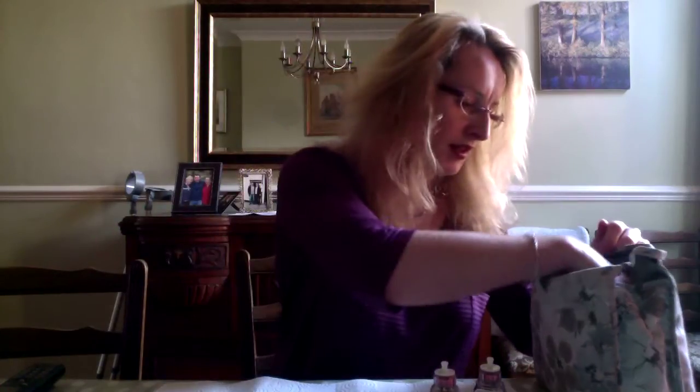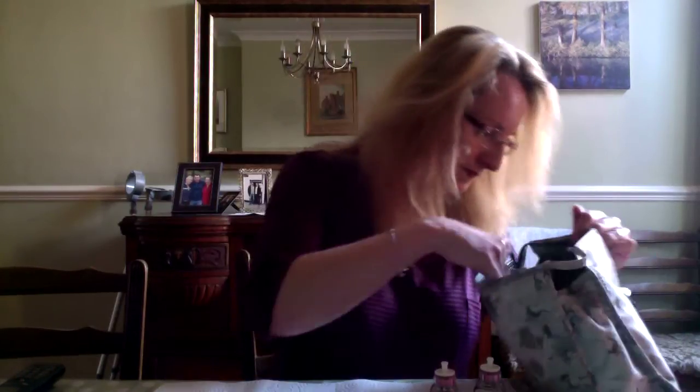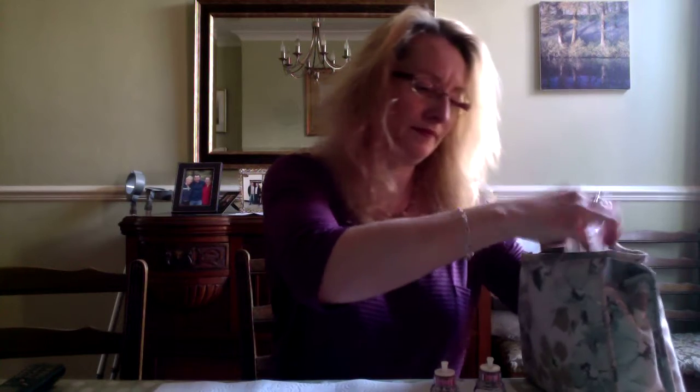So I've got the treatment. I mixed it up earlier because I like to give it half an hour or so to mix. I have cotton wool — little cotton wool balls — my butterfly, 23G, very important, I like that one, and it's blue. Tourniquet, also blue coincidentally — this is weird, everything's blue. Maybe I should invent pink stuff. Swap. And a syringe — 30ml syringe.